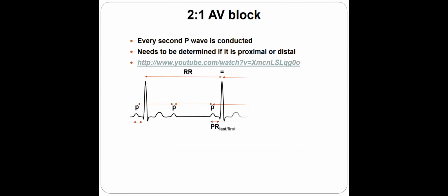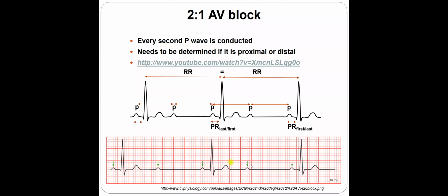That's rhythmic, but the ventricular rhythm is half as fast as the PP. Based on the 12-lead ECG, you cannot diagnose Mobitz type 1 or type 2 here.